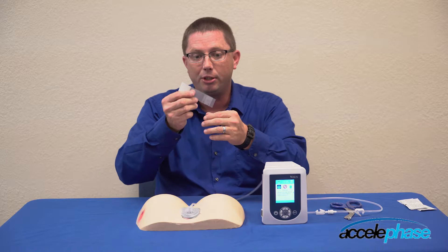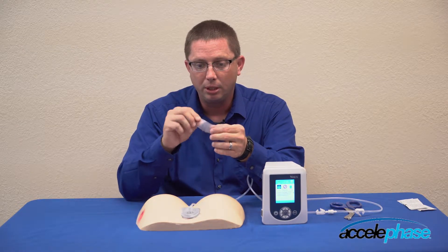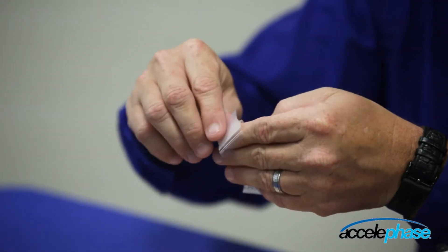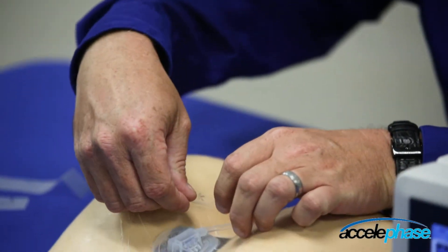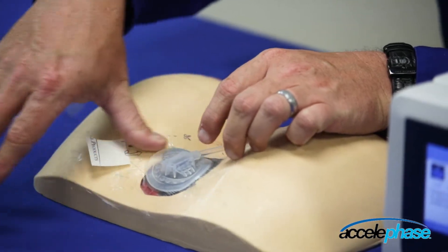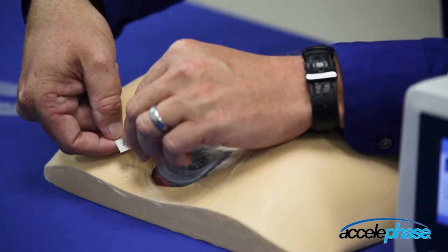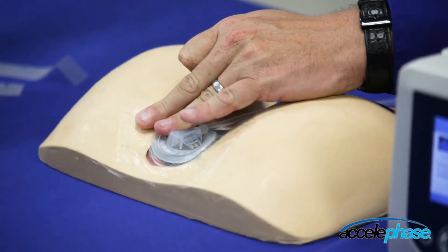Once the air leak is identified, you can take a piece of the drape that you use to cover the wound. Undo number one on the drape, undo number two on the drape, and you can reseal the area where the leak is. Ensure on the drape that you remove the number three backing, then pull the tab.